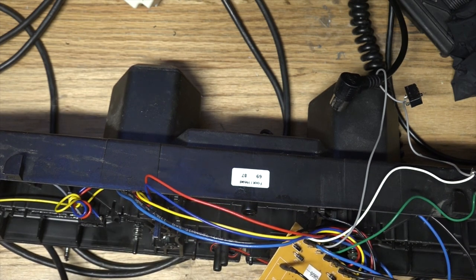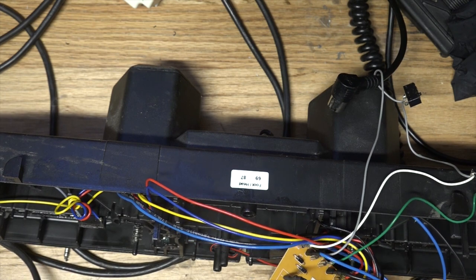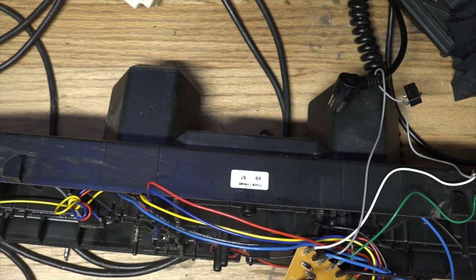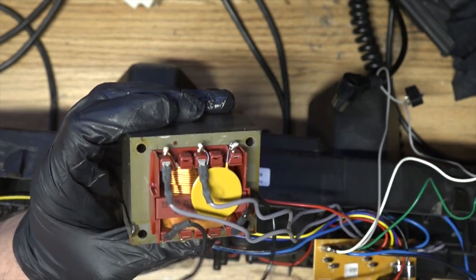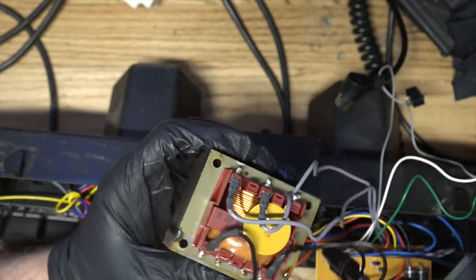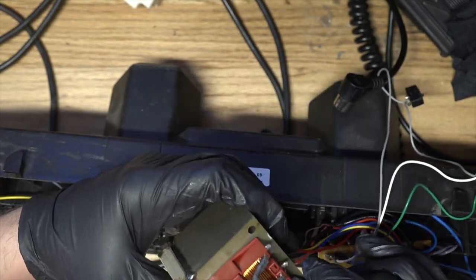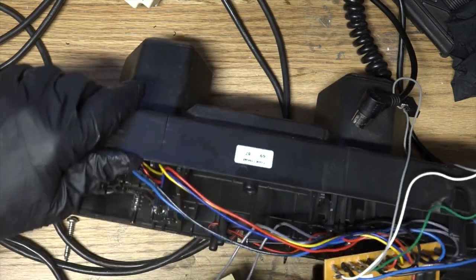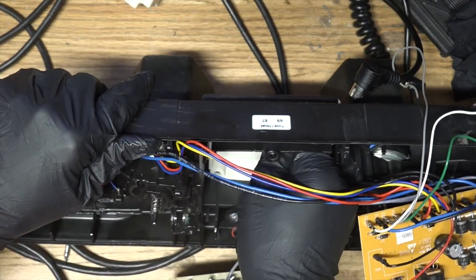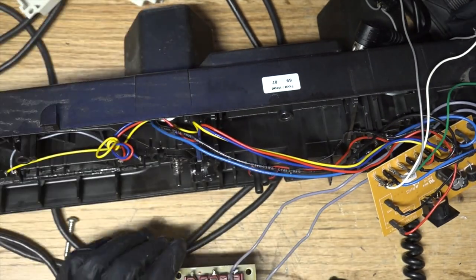Yeah, so just a line voltage coming in on these two, and then it's the service voltage coming out on, let's get it on camera. So it's just the line voltage coming in on these two leads through the fuse, and then it's the service voltage just coming out to the board down there as AC. I wonder if this cover will come out too. Yeah, there. The cover's out too.